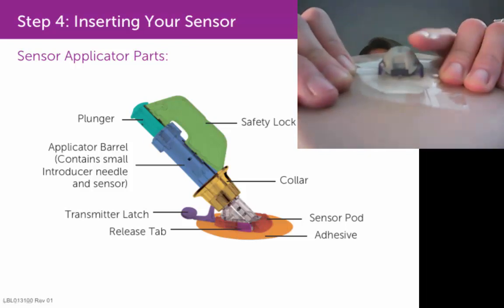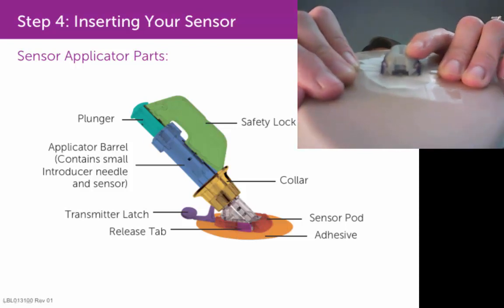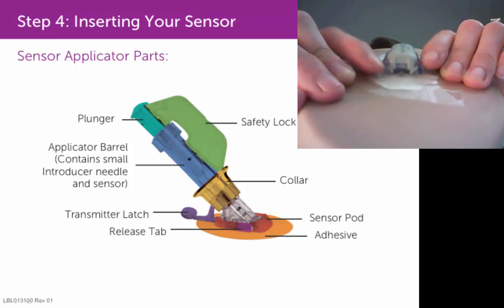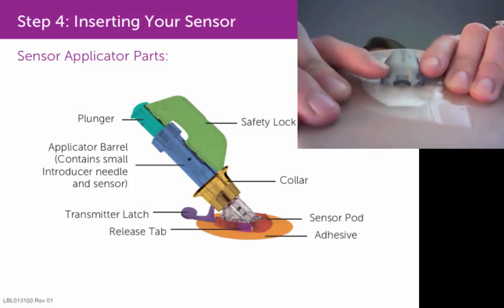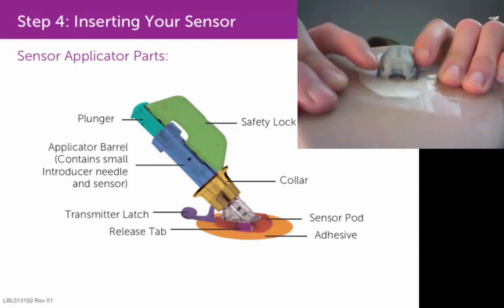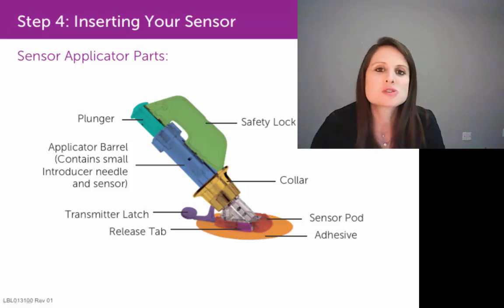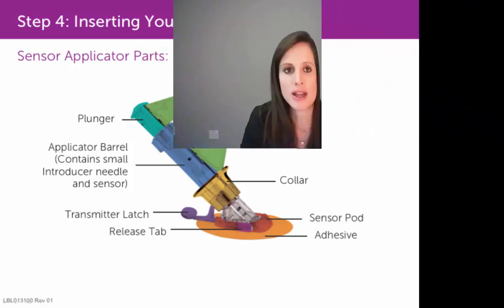If you see that, just press down on that side of the transmitter, and that will click it into place. Make sure that both of those little gray triangular pieces are seated below the plastic wings or prongs of the sensor pod. Even if you think you heard two clicks, I still recommend that you visually inspect the back of the transmitter to make sure it's fully clicked into place.